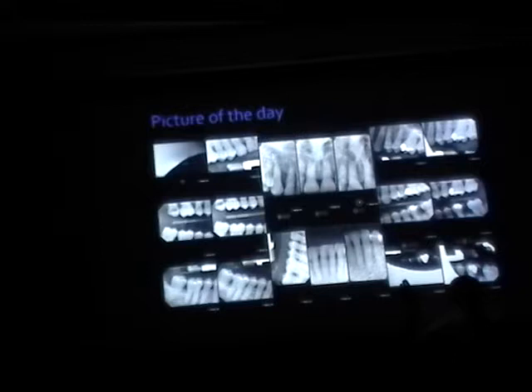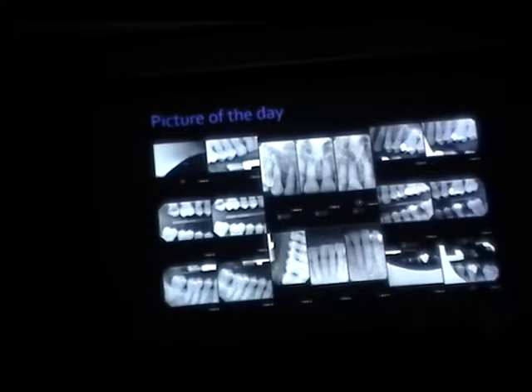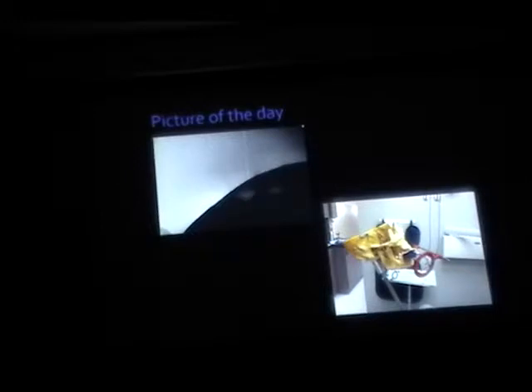Our right. Okay, this looks better, right? What could have happened here? It's probably overexposed. Yes. But how does that happen if it's preset? All you do is press the button and insert. How do you hold it for longer? You shouldn't be able to do that, right? If you increase the time on the machine, it just. Oh, okay. So, before I give my answer, what do you see here?